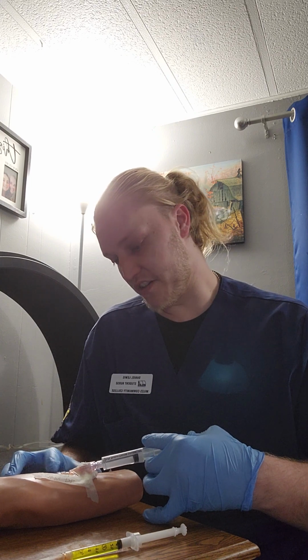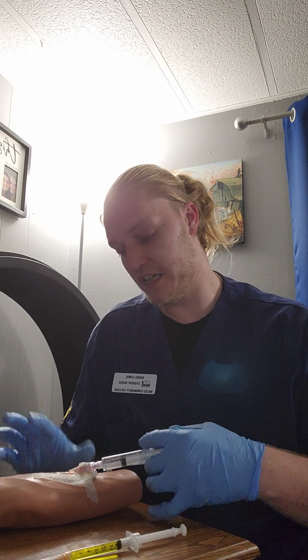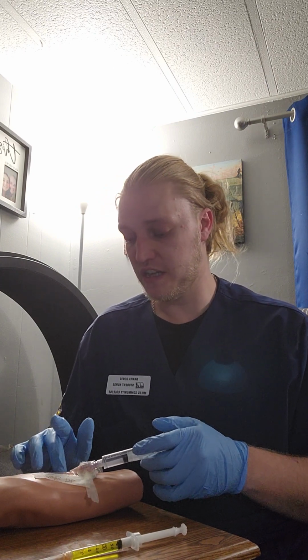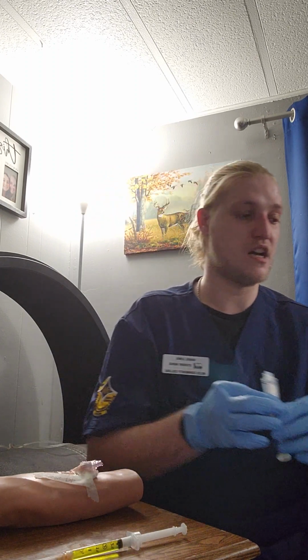While I'm doing this flush, I want to make sure that there's no infiltration, redness, swelling, anything like that happening while I'm actually doing the flush. So nothing like that happened. Everything is still good. No swelling, no redness, no infiltration, phlebitis. So I went ahead and did that.